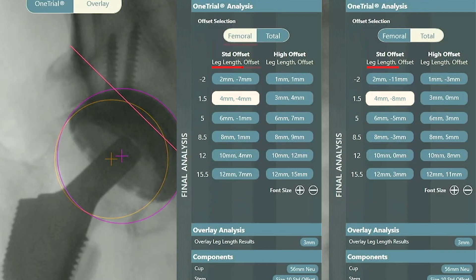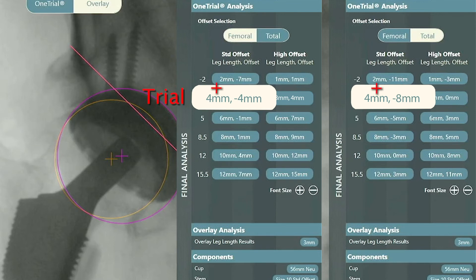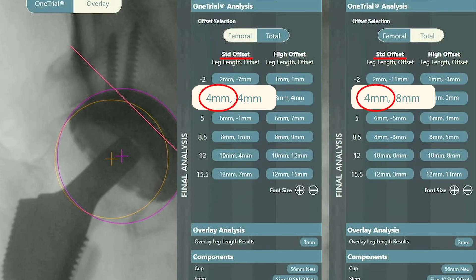For a typical arthritic hip my goal is to add length as determined off of my pre-operative exam and radiographic measurements. I also want the femoral offset to be positive and the total offset to not increase. Looking at this chart there are several good choices that a surgeon can choose from depending upon the goals of surgery. Alternatively there are less desirable choices that could result in leg length or instability issues. Based off the one trial data generated here I like where the patient's leg length is with a plus 1.5 head.